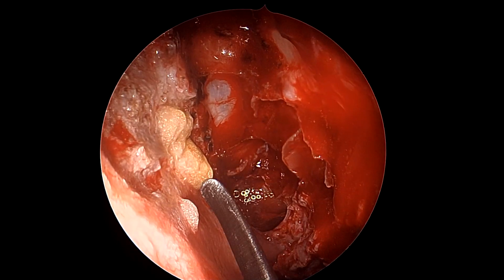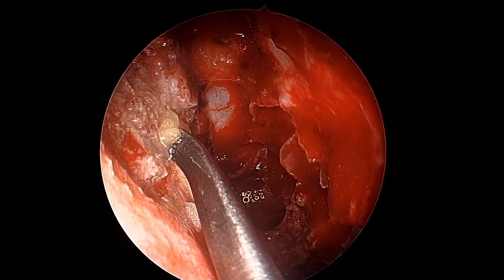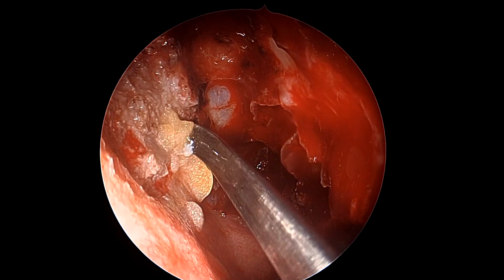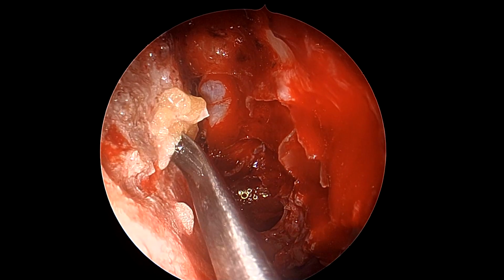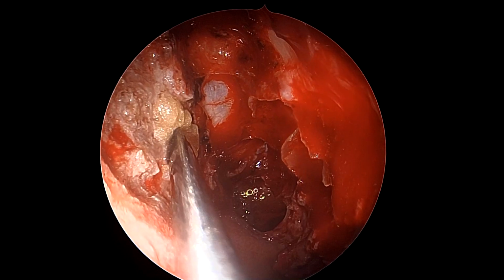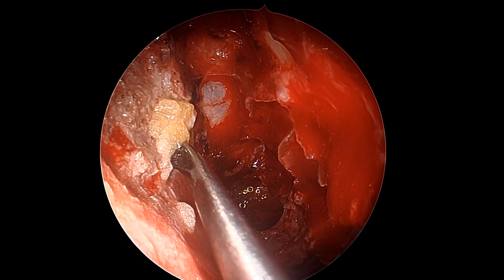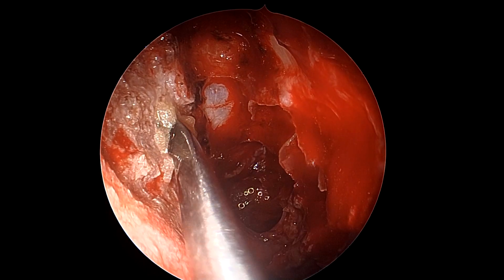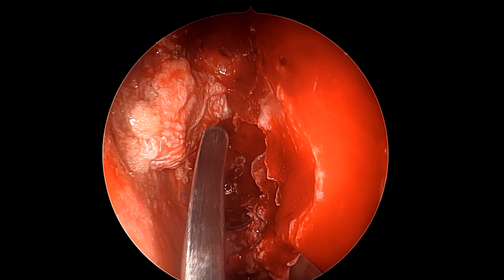The only thing you want to check, double check and triple check is the fact that the fat is nicely tucked in. It's not just lying loose there, and a good amount of it must have gone inside the defect and must be protruding in the intracranial cavity before we can be sure that this is well set. A slight overfilling of fat is good because we assume that some bit of it would get reabsorbed in the coming weeks or months. So just to be sure, we use a little extra fat, and if there is a little extra, we could also even trim it down with the fine scissors once we have placed the bulk of it inside the defect. And now we see that it looks nicely set in there.